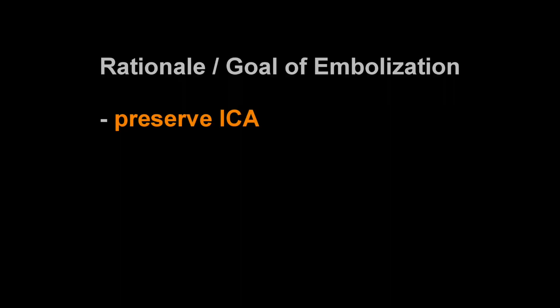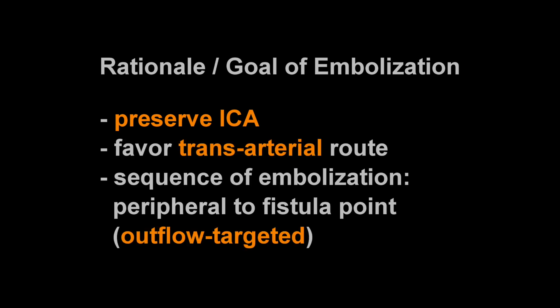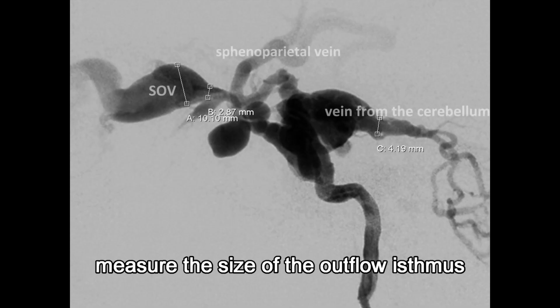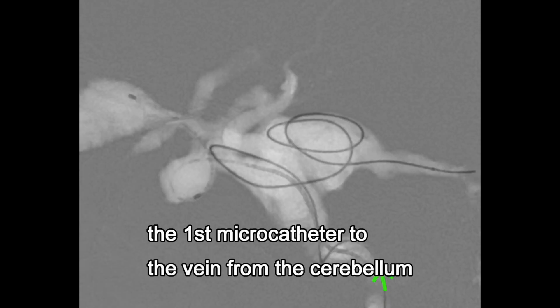The rationale of embolization is to preserve the ICA. We favor the transarterial route first, and the sequence of embolization is from the peripheral to the fistula point — outflow targeted. We navigated microcatheters into each outflow channel.